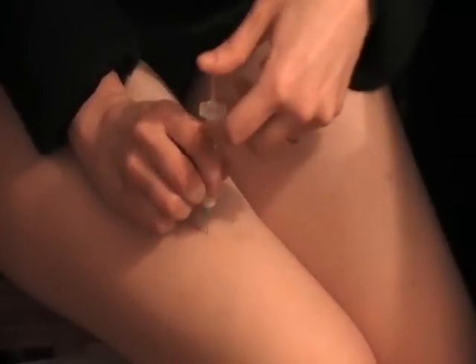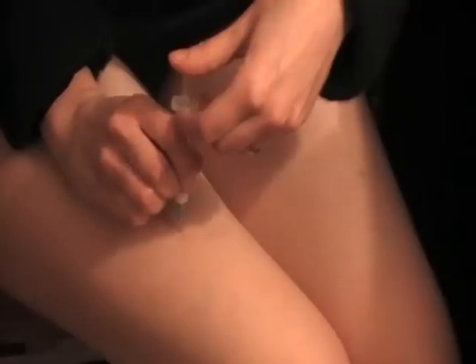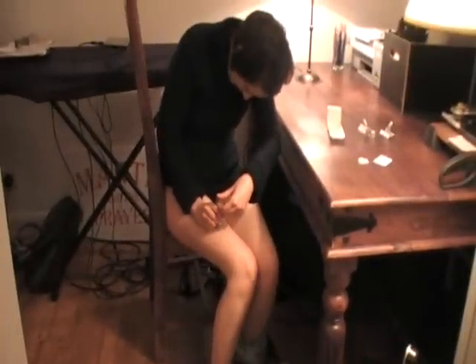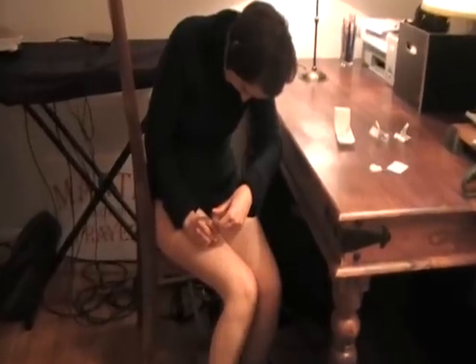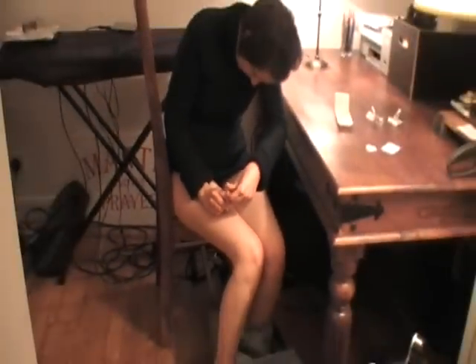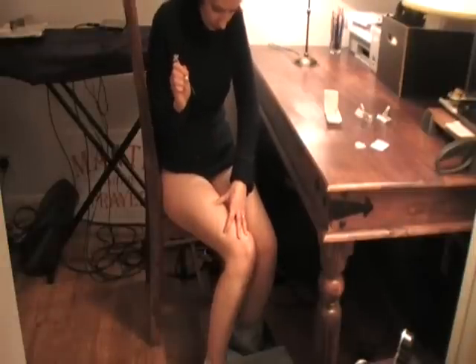Then you count to ten as you're pressing: one, two, three, four, five, six, seven, eight, nine, ten. And pull straight back out. Usually it does bleed a very tiny bit and you just swipe the blood away.